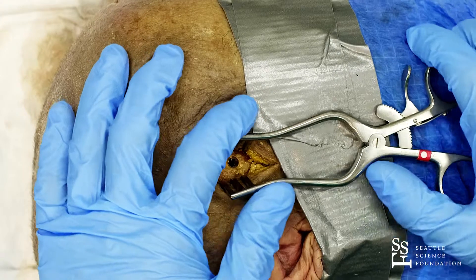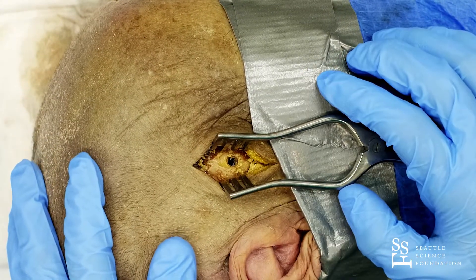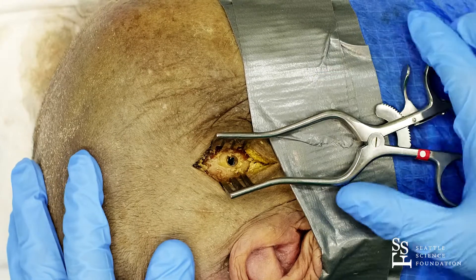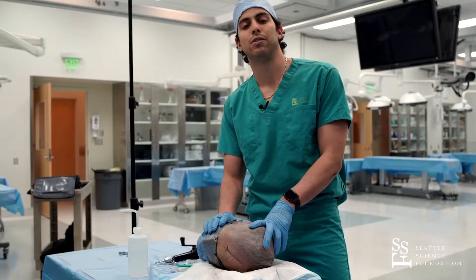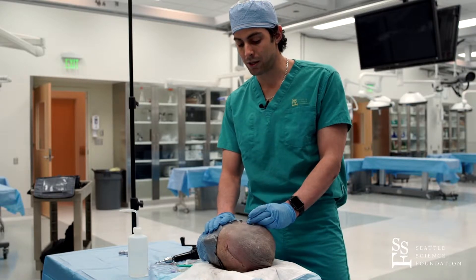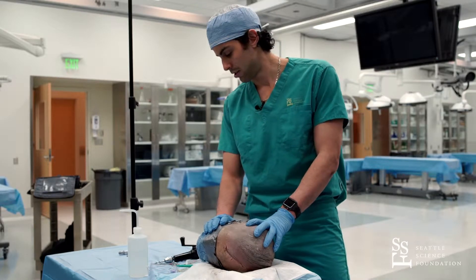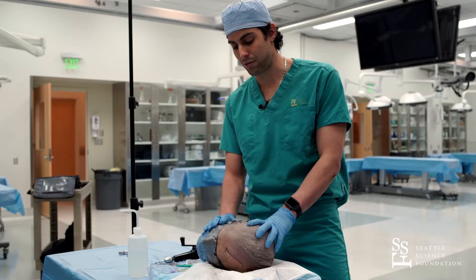That softer feel will indicate that the drill has crossed the temporal bone and reached the epidural space. If you are facing an epidural hematoma, you will immediately access a blood clot which you can evacuate or release pressure over.